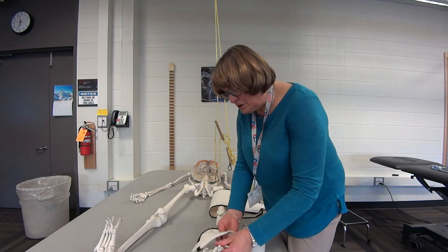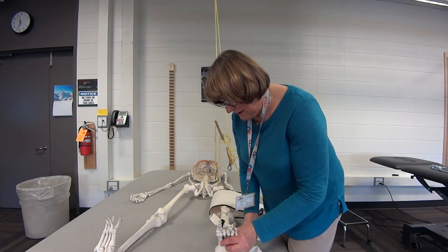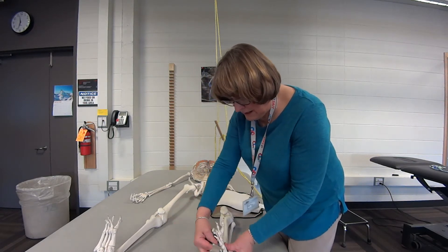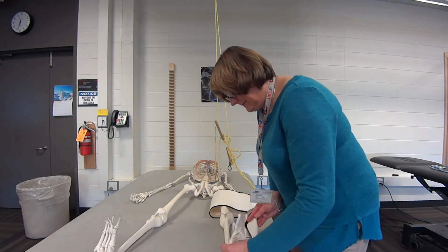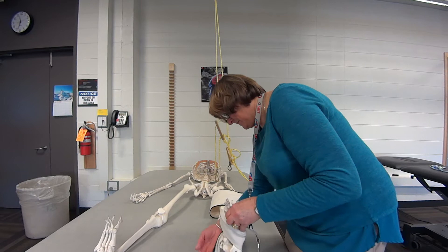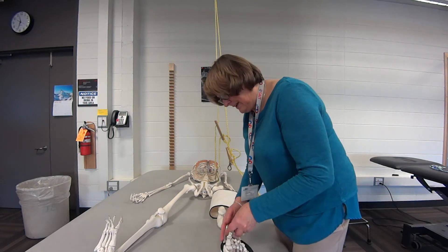What you can do on the foot is almost like a figure of eight — going over the forefoot and then around the ankle so you're getting good positioning. Again, try to make sure that you've got equal distance on both sides.